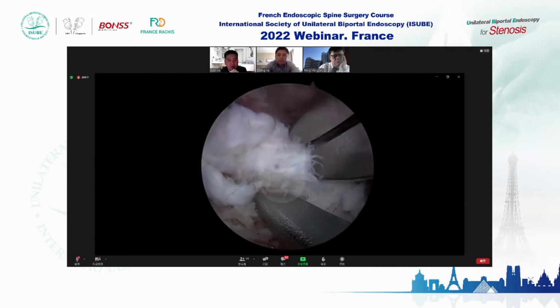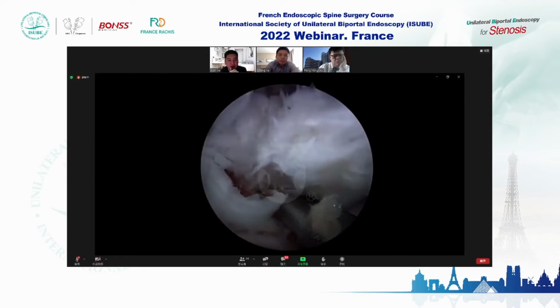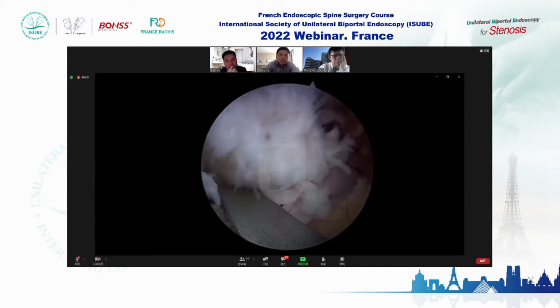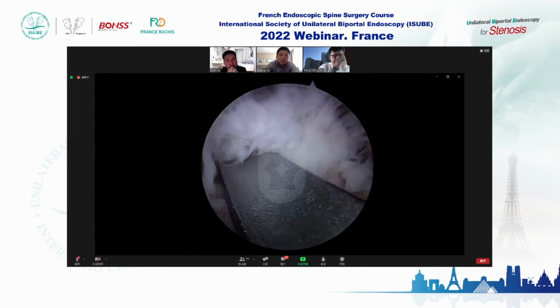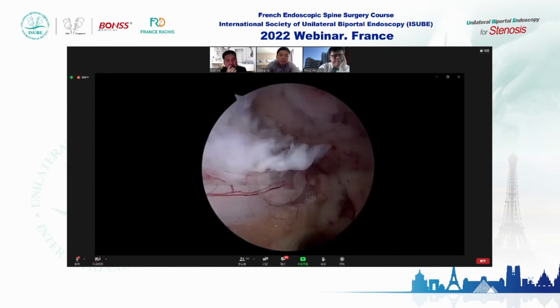Then I think there is enough surgical field. But for this case, maybe the ipsilateral portal is enough, I think.